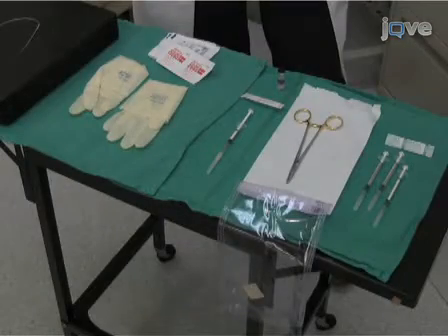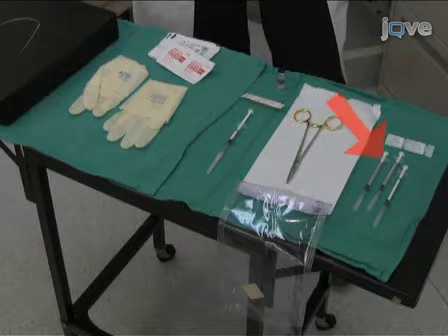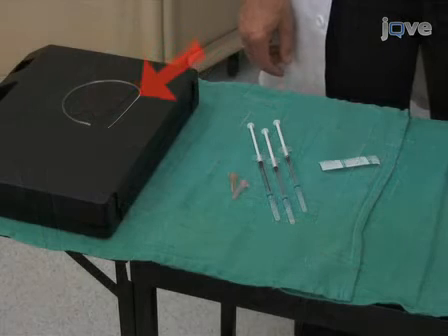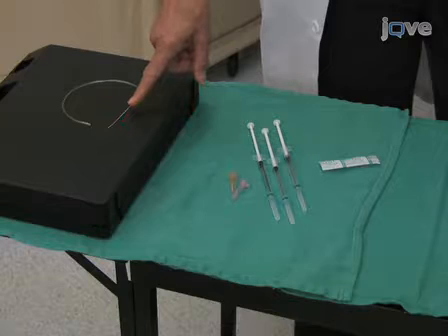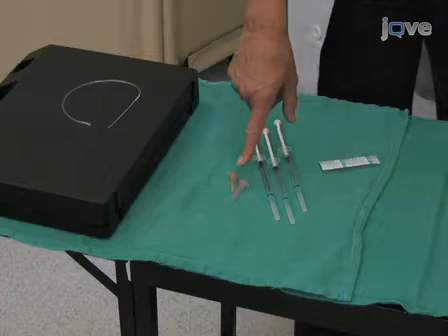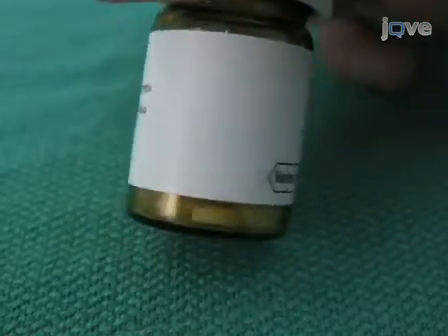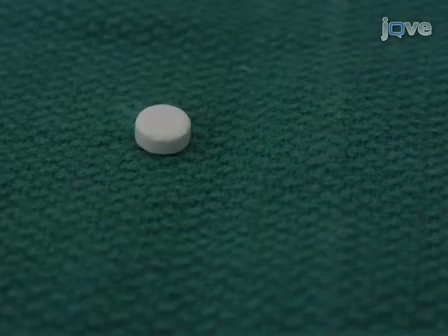Before collecting the specimens, prepare a staging area with sterile gloves, a sterile needle holder, and 1 cc Luer tip syringes with 23 gauge and 30 gauge needles. You will also need microdialysis catheters attached at one end to a 4 cm 23 gauge needle. Samples will be collected in 1.5 milliliter microcentrifuge collection tubes containing 4 microliters of protease inhibitor solution per 100 microliter sample. Protease inhibitor solution is made per manufacturer's instruction using protease inhibitor cocktail tablets.